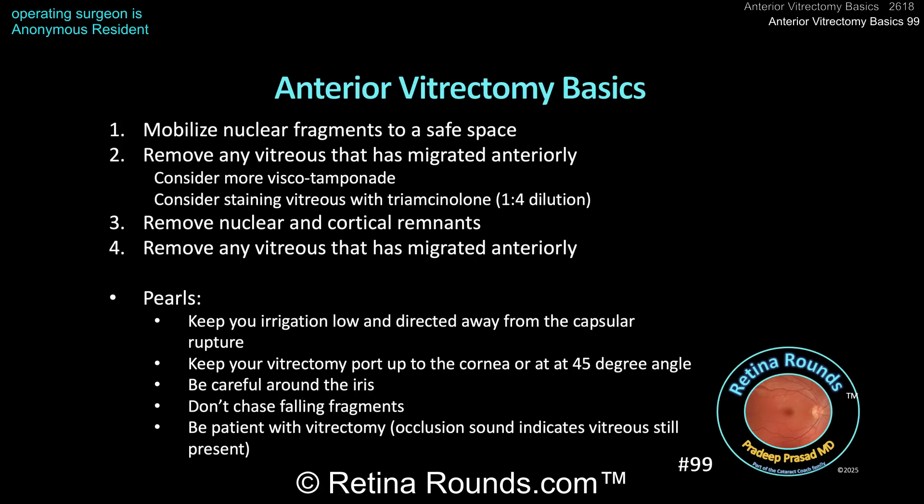When using your vitrectomy handpiece, keep the vitrectomy port up towards the cornea. Don't point it down to the posterior segment — that's just going to draw more vitreous up. Start by keeping the port up towards the cornea, then tilt it at a 45 or even 90 degree angle to engage any vitreous in the anterior chamber. Move slowly; don't make sudden movements. Use the fluidics in your favor — let the vitreous come to you. When vitreous is no longer coming to the handpiece, move towards the stained vitreous. Be very careful around the iris, as high vacuum can easily pull iris into the mouth of the vitrectomy handpiece, causing an iris defect.